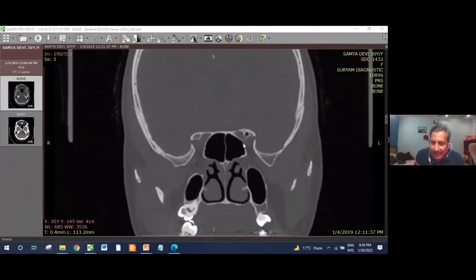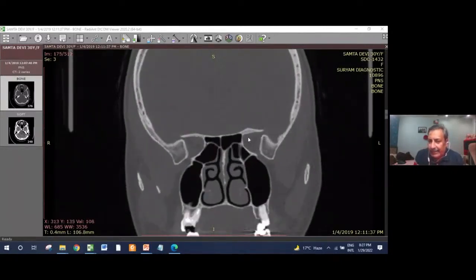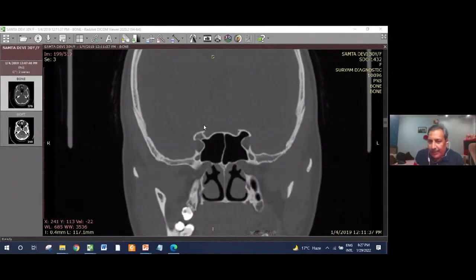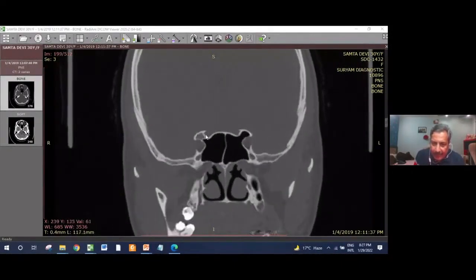That's the optico-carotid recess. That's the optic nerve making the mark over here, the indentation of the optic nerve here. Here the optic nerve runs into the orbit like this. If I come anterior, this is the orbit, and that's the optic nerve going behind here and forming the optic chiasma here in the roof. So that's the optic nerve coming here and the optic nerve coming this side. See this? This is the optic nerve.